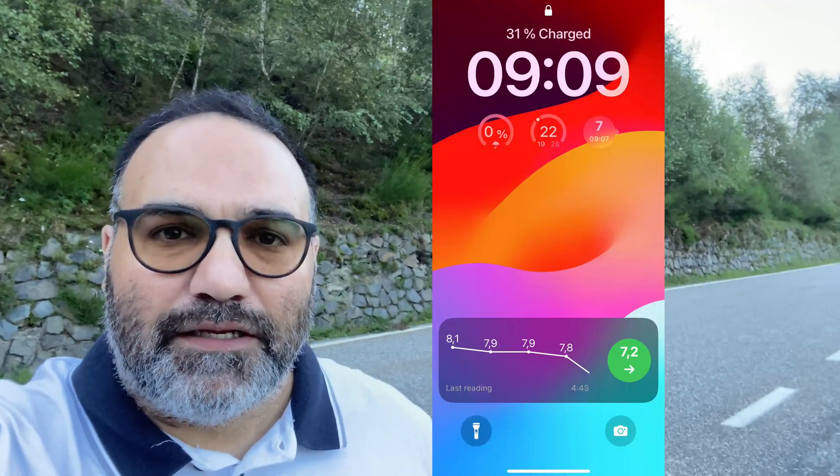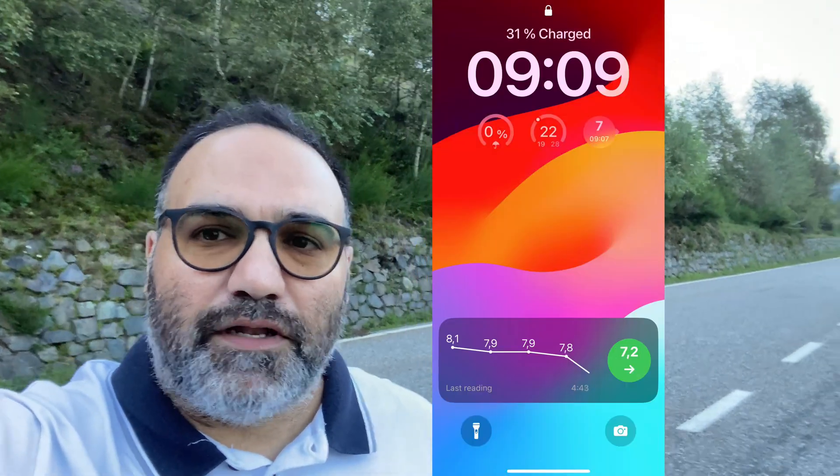Hello to all diabetics. This video is specifically for diabetics. I recently came across an app called Sweet Dreams, which I found good and would like to do a very short review about, more specifically about the live activity feature on an iPhone.